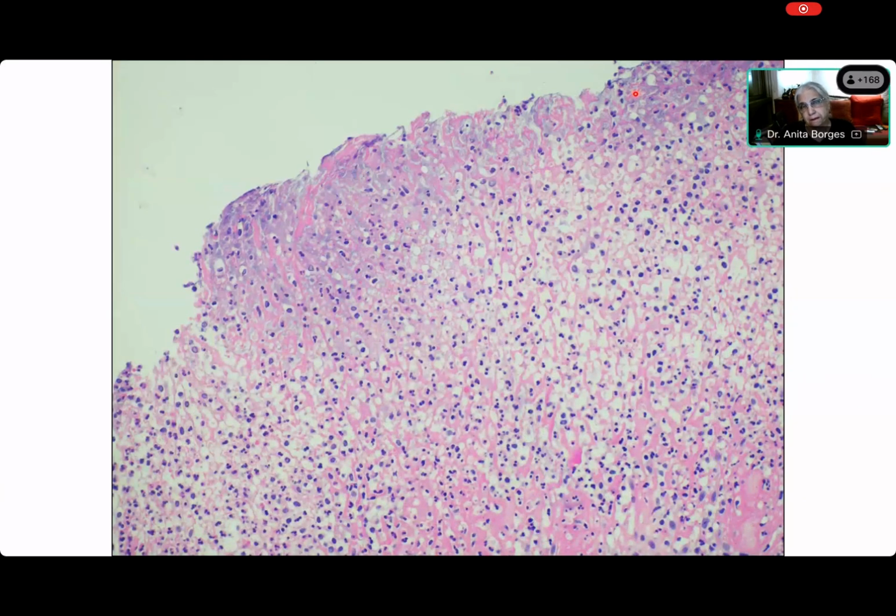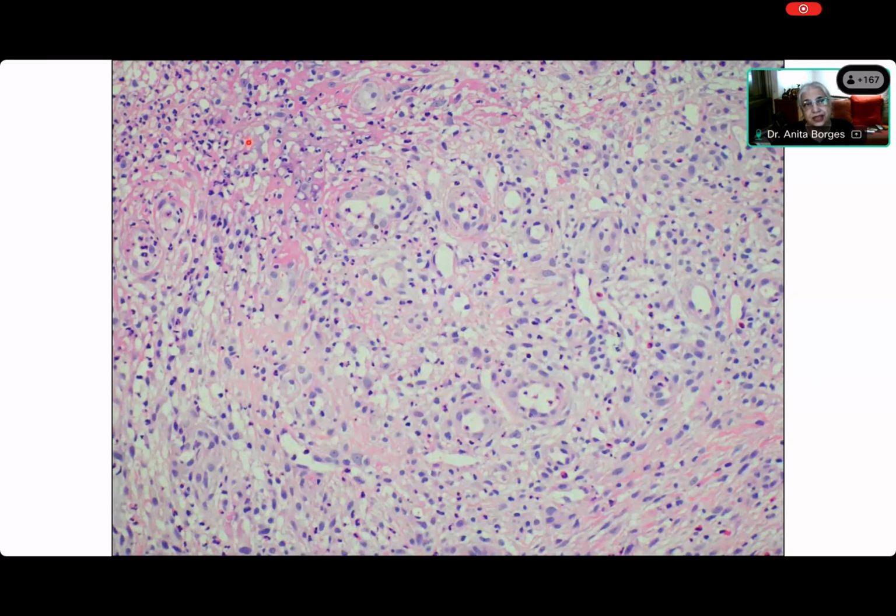You see this blue thing, which is... And there are no spindle cells. Okay, you see the fibrin network in which the neutrophils are there, and you see this leaky stuff that is there, and now you see the base of this ulcer. And this base, which is the interface between the abnormal tissue and the normal tissue, for the first time, you are beginning to see spindle cells.